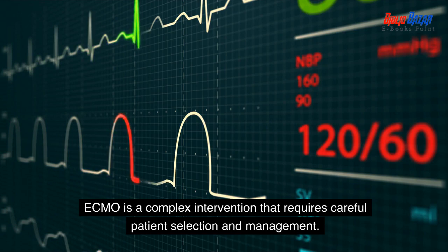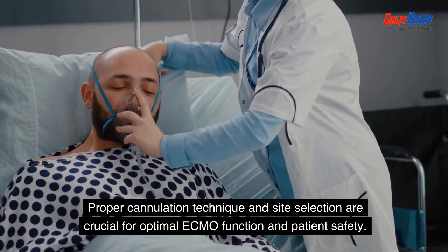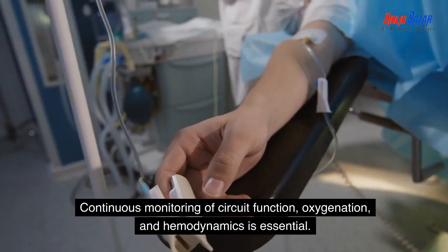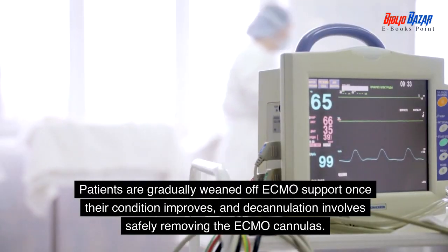ECMO is a complex intervention that requires careful patient selection and management. Proper cannulation technique and site selection are crucial for optimal ECMO function and patient safety. Anticoagulation with heparin or alternative agents is typically used to prevent clotting in the circuit. Continuous monitoring of circuit function, oxygenation, and hemodynamics is essential. Patients are gradually weaned off ECMO support once their condition improves, and decannulation involves safely removing the ECMO cannulas.